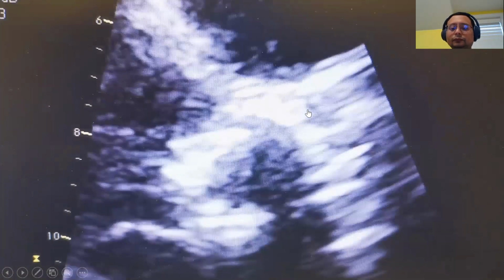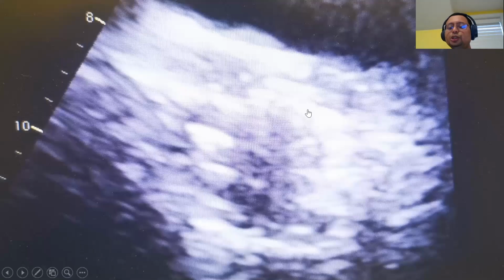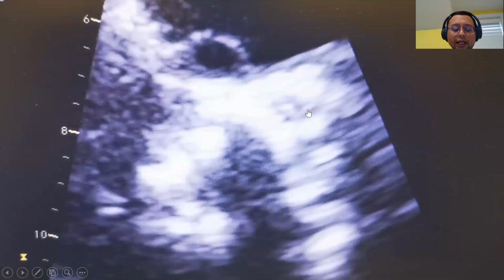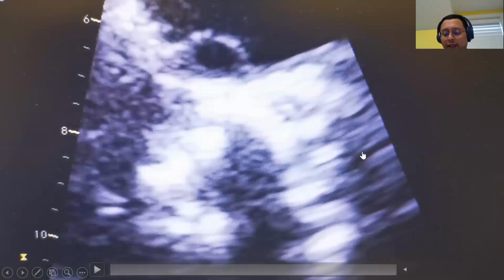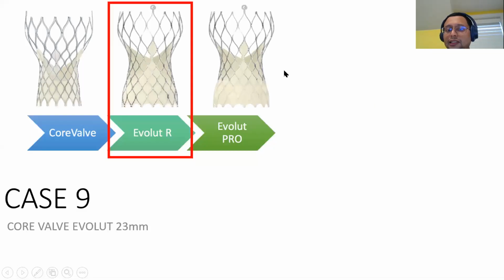Right, so that's the CoreValve. With a CoreValve, usually you measure it... All right, I just wanted to tell you the reason I show you this is for you to familiarize yourself with the transcatheter valve, because this will become more and more frequent. So this is the CoreValve. The way to assess it is the same as other valves. However, you can see the CoreValve is long.